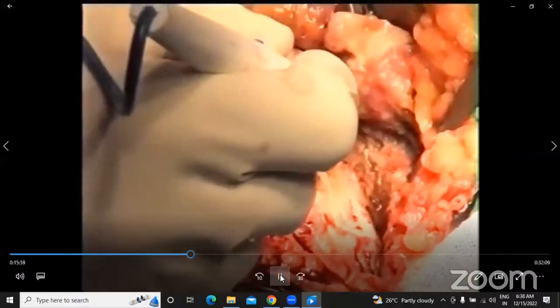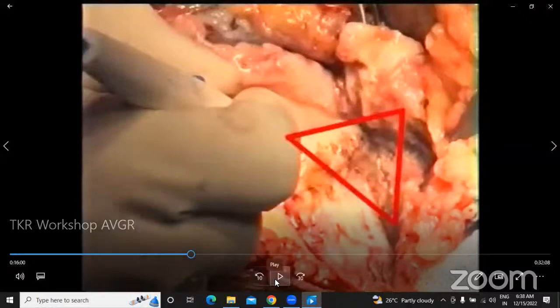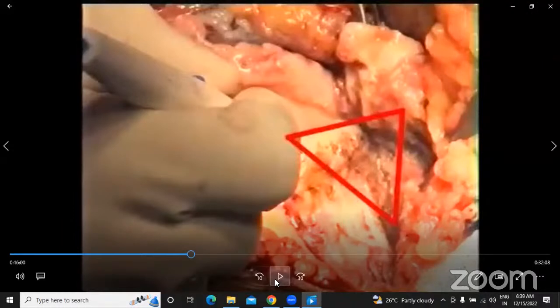So here again, if you are horizontal, it's only for exposure. As you go vertical and keep releasing, that is when you're creating more space in your flexion or extension gap. So remember, all the youngsters, as you're releasing along the tibia, it's meant for exposure. But if you want to open up your flexion gap later, the more vertical you go, the more release in terms of balancing. But the more horizontal you go on the tibia, it is mainly for exposure. Basically, technically speaking, this is not a medial release. This is something that we do regularly just for exposure. Effectively, you're lifting off the deep MCL.